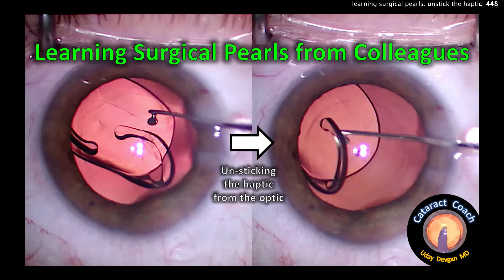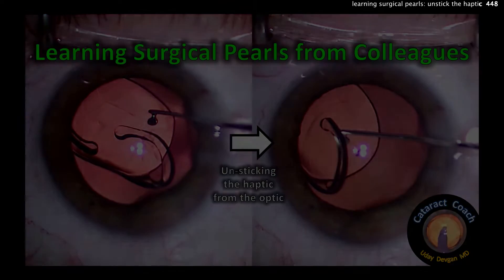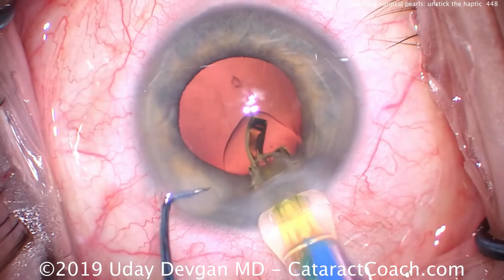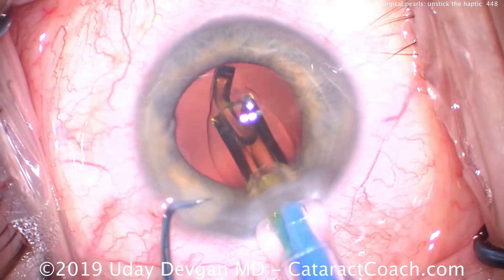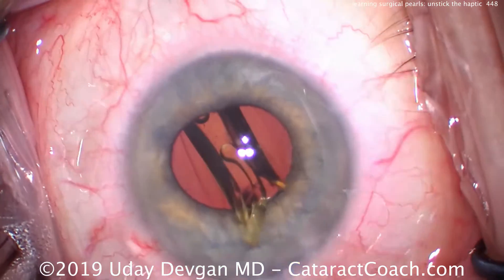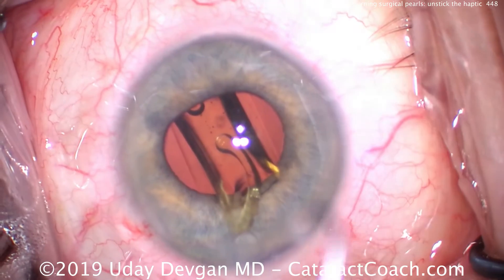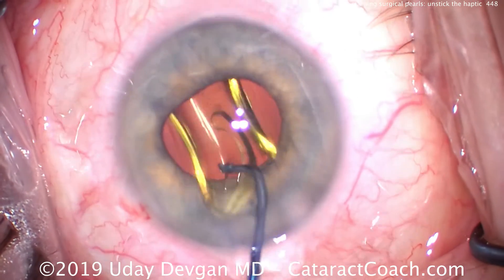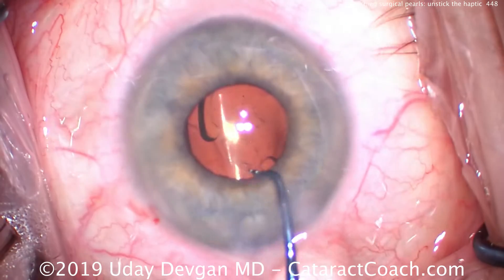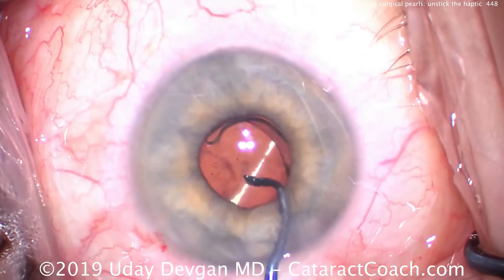Welcome to cataractcoach.com, learning surgical pearls from your colleagues. Here's a pearl to unstick a haptic. In my routine case, I'm using a single-piece acrylic monofocal lens. We're placing it in the capsular bag using a pre-loaded injector — we just add viscoelastic as we place it inside the eye, deliver it into the capsular bag, and let the haptics open up. Usually just a little nudge from the chopper and both haptics open up.